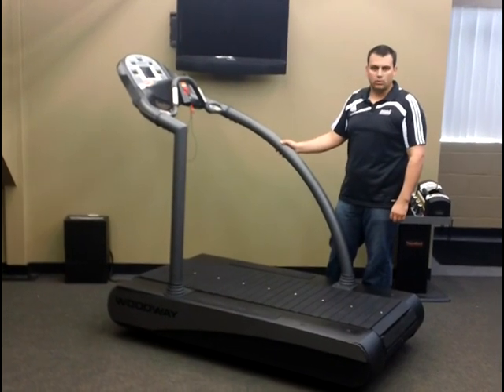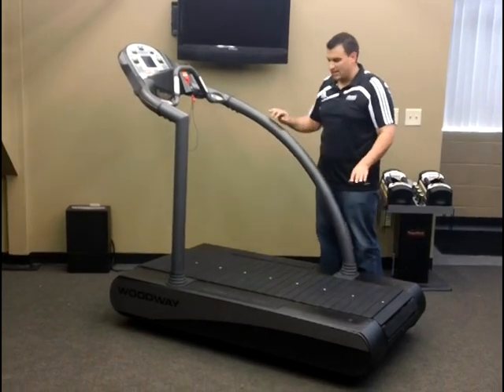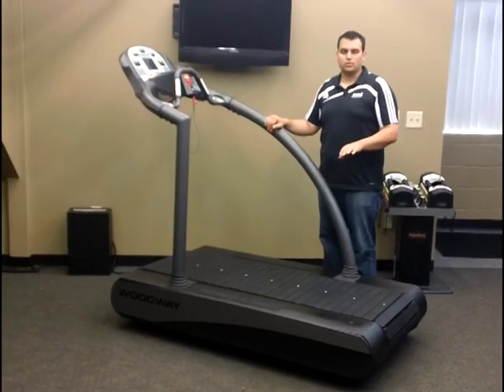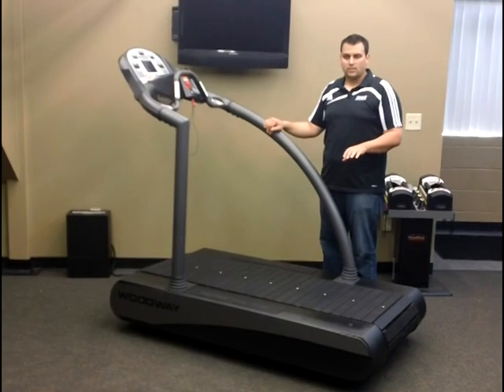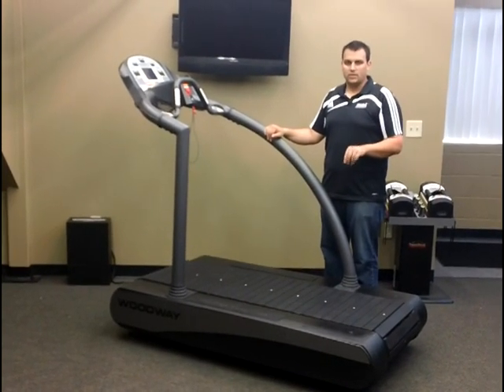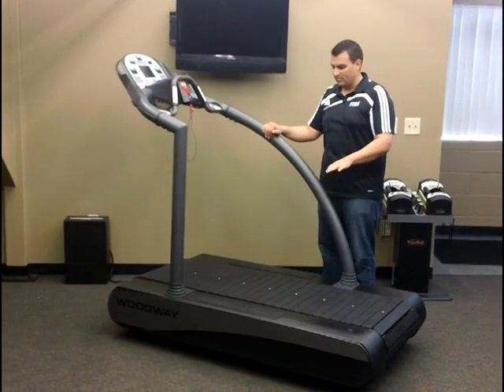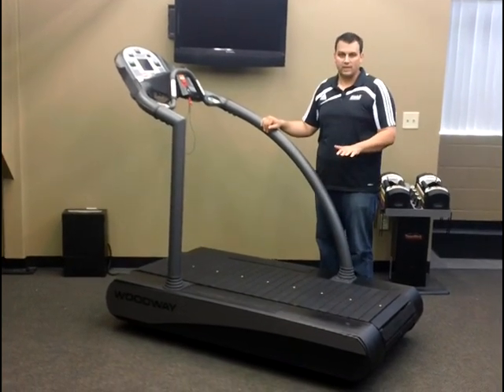Something else that's very unique about the Woodway Treadmill is the rubberized slat design. The rubberized slats are designed to absorb shock at the point of impact, versus a traditional deck-like treadmill that would potentially flex or bounce. This will provide a very solid platform for doing gait analysis.